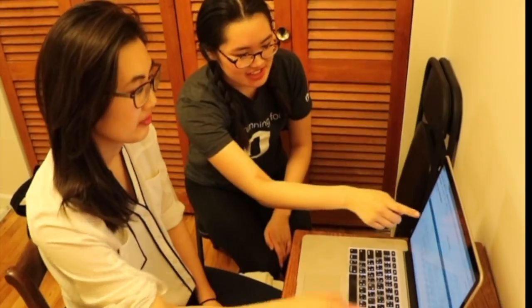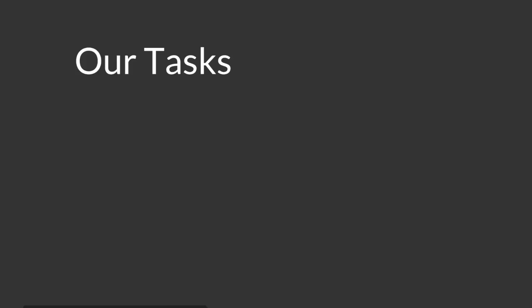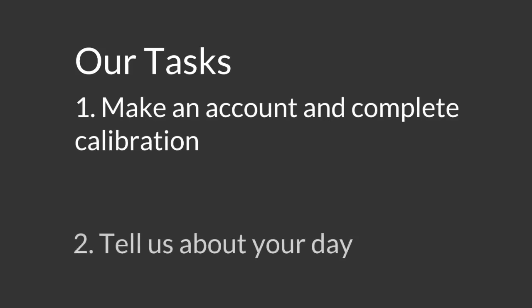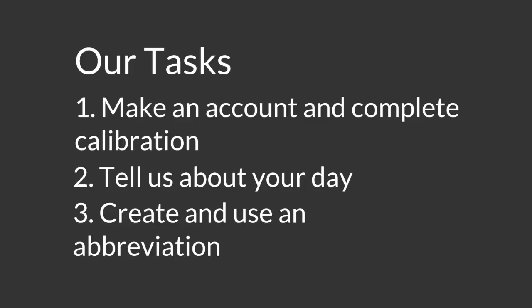We conducted experiments to see how people who had never used Morse Decoder before would interact with the device. We asked 5 different users to complete 3 tasks. Make an account and complete calibration, tell us about your day using Morse Decoder, and create and use an abbreviation.